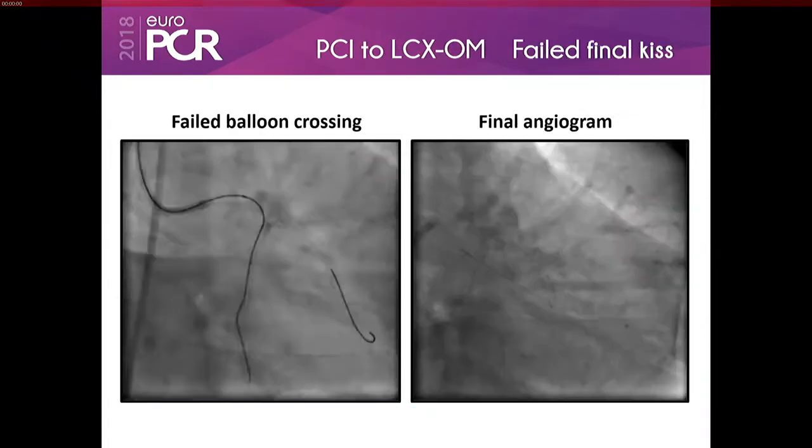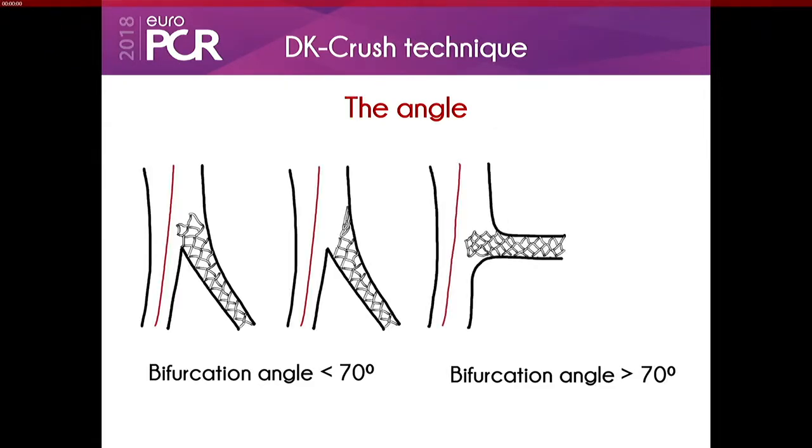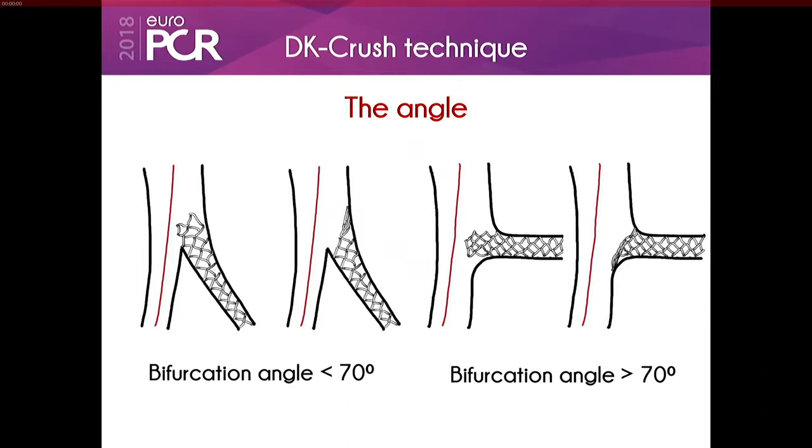And I think that's, Dr. Amin, what you tried to show here is how it's going to be crushed. Of course, this is not proven bench testing, but I think it's pretty close. So perhaps I would agree, and that's, I think, the message of your case today. When you have such an angle, and when you have a dissection, and when you have a marginal which is so much bigger than the circ, and more important because the circ is going in the groove, there's only one little tiny PLOM that goes out of the groove.